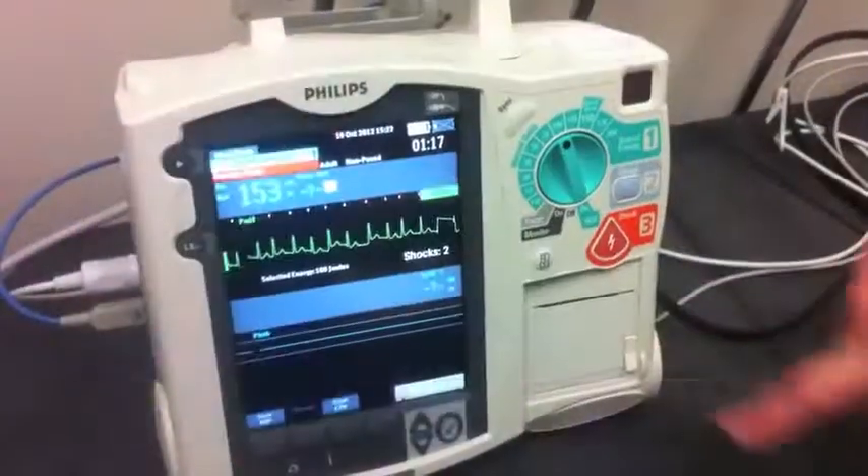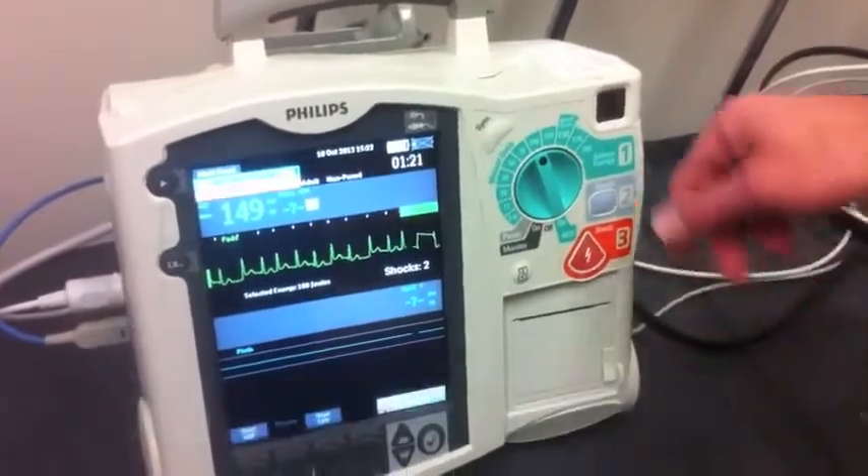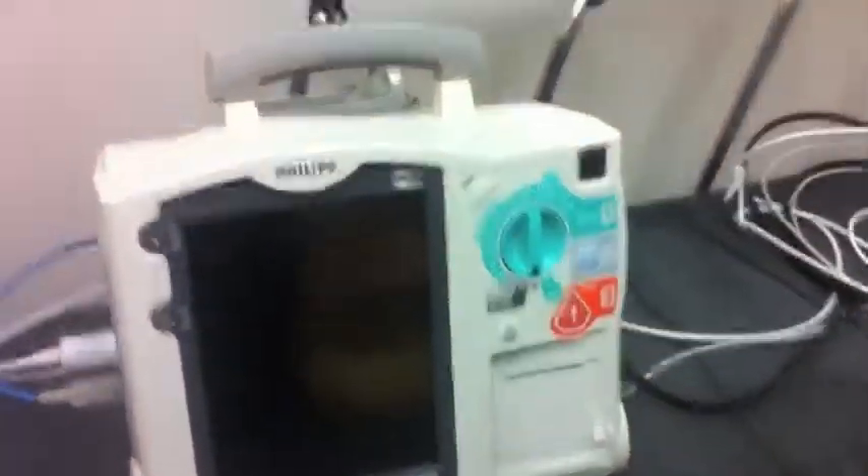Then we're going to deliver the shock. You will have to press and hold the shock button to make sure it shocks. Done.